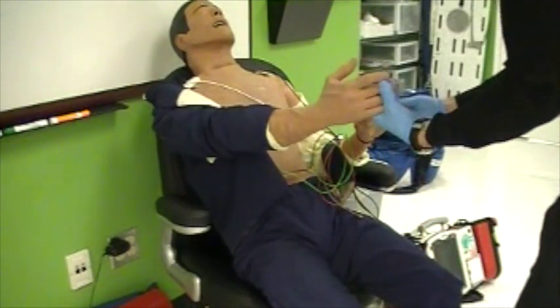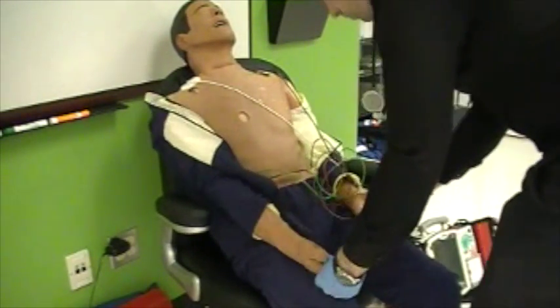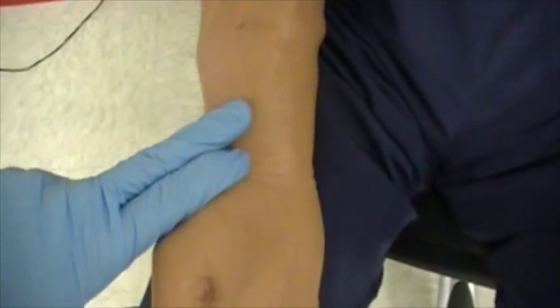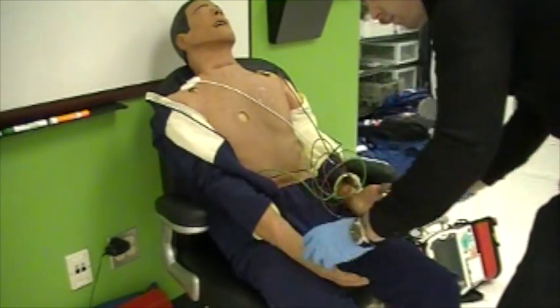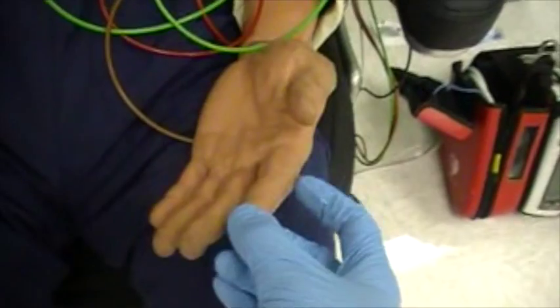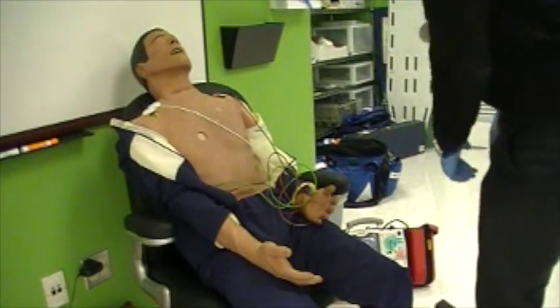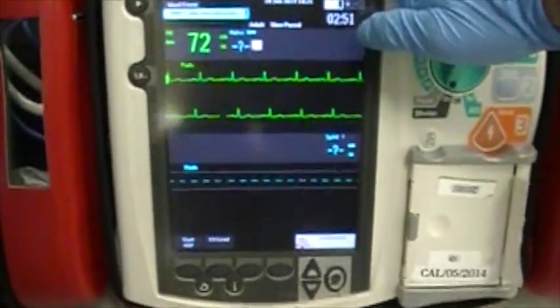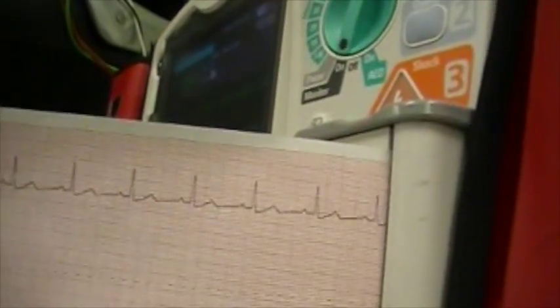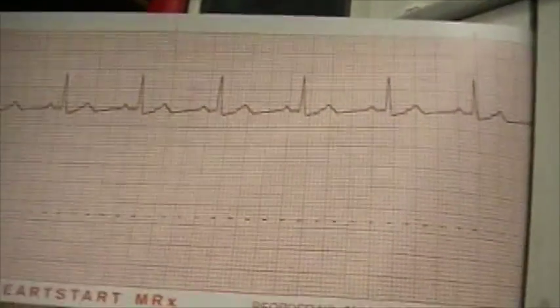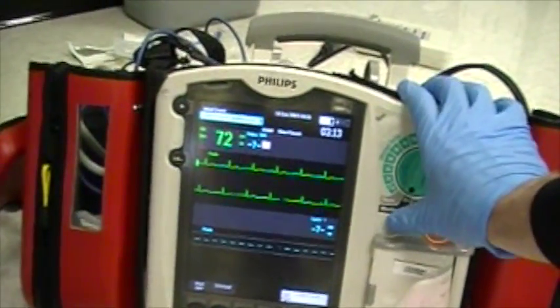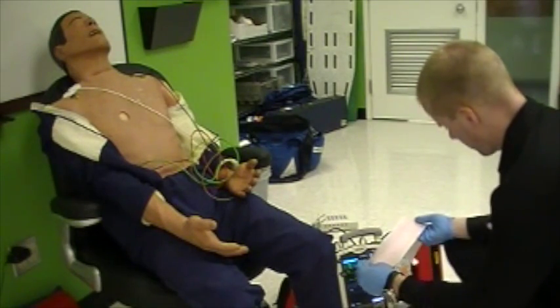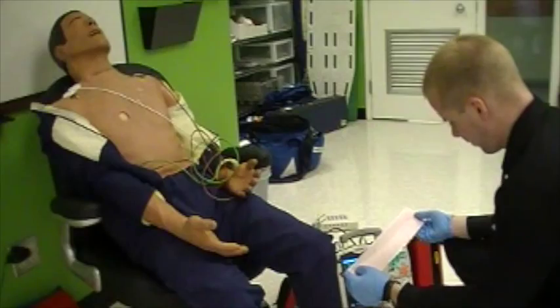Now assess the upper extremities for grip strength — both grip strengths should be equal. Then assess radial pulses; they should be equal and of adequate rate, rhythm, and strength. Assess for the presence of sensation and motor function in both extremities. At this point, your partner should have obtained a full set of vitals and attached your patient to an ECG. Print an ECG strip. Review the strip and assess for any obvious abnormalities or apparent deviations from baseline.